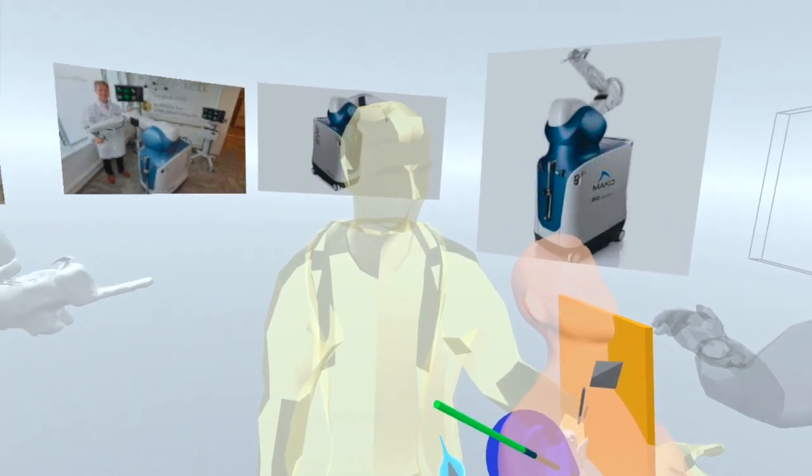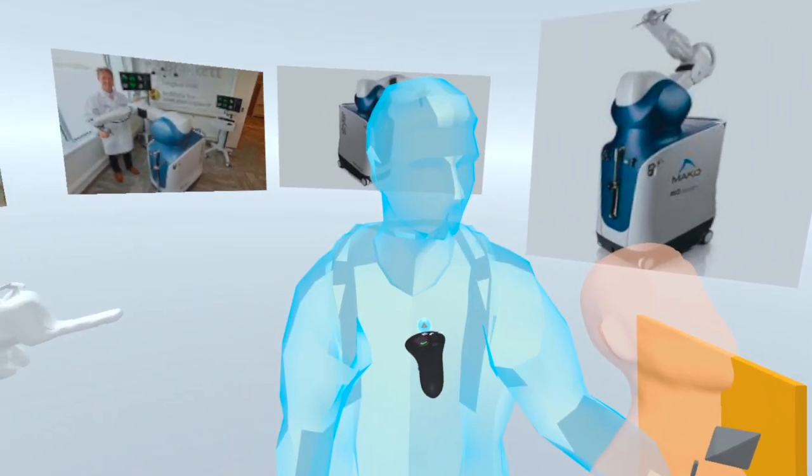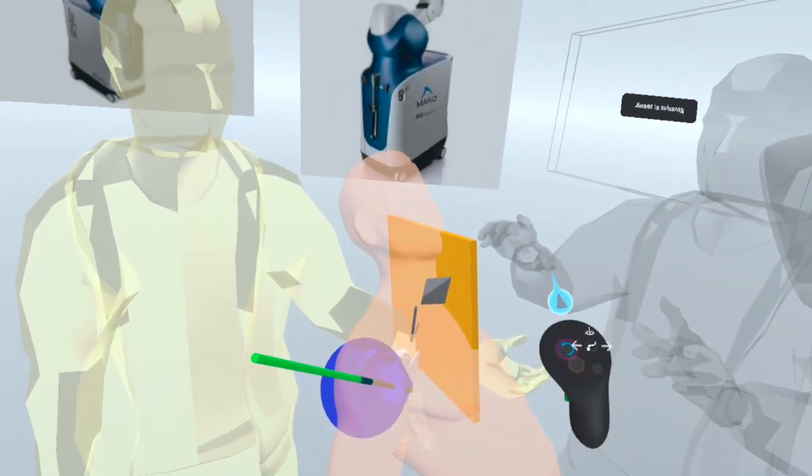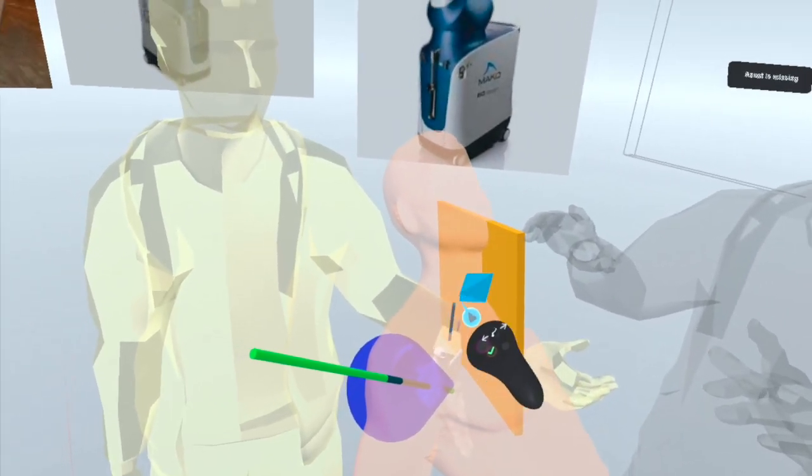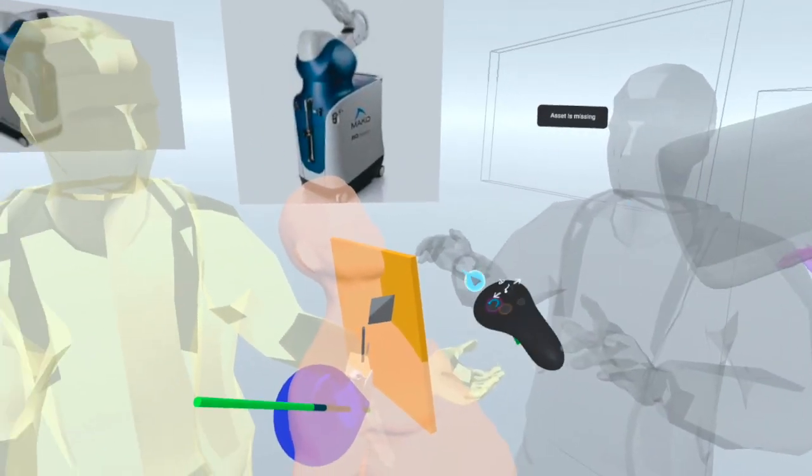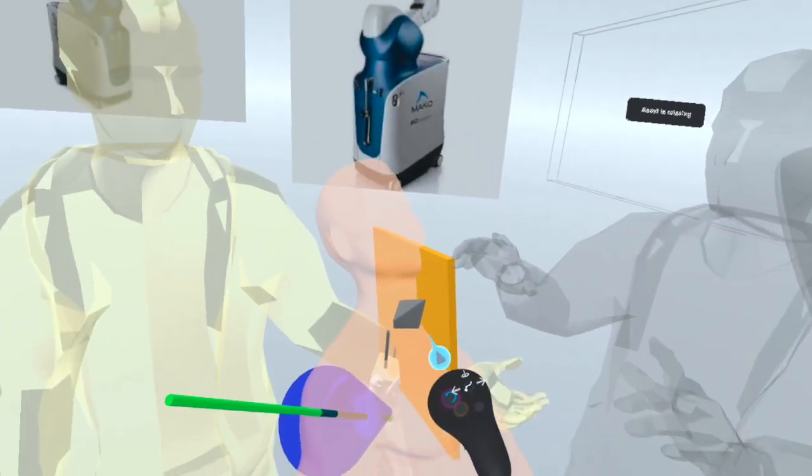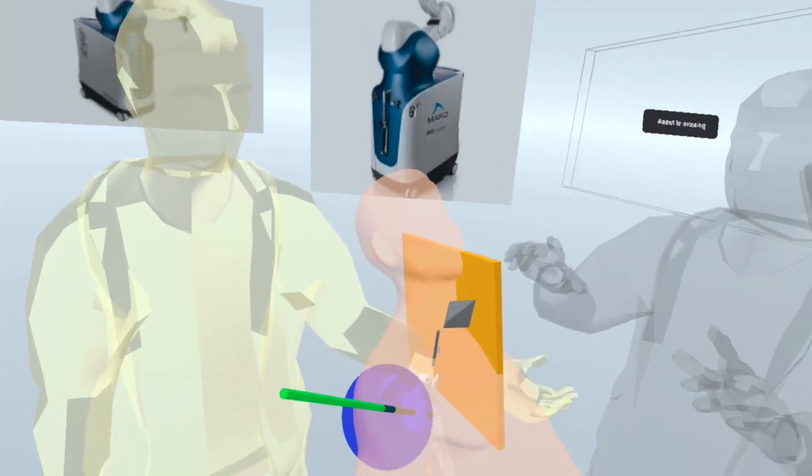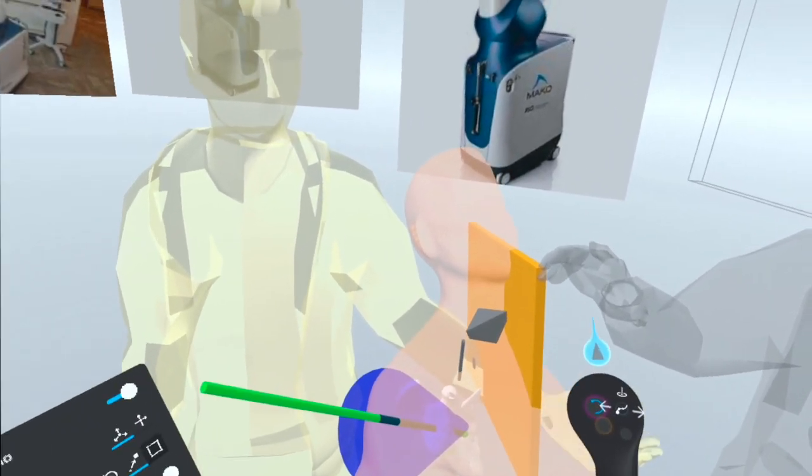We have here a patient in a beach chair position. We have the first doctor, the first auxiliary right here, and a second auxiliary right here. Here we have the tracker for the navigation system, so it has to have some vision for the navigation system.